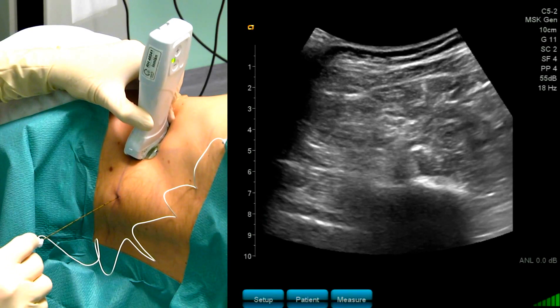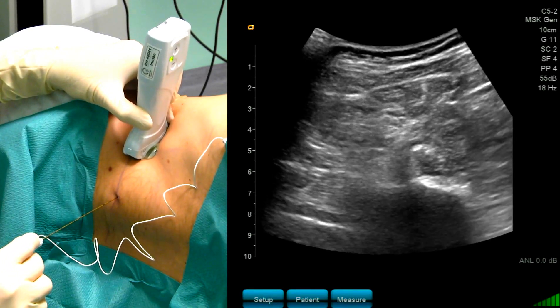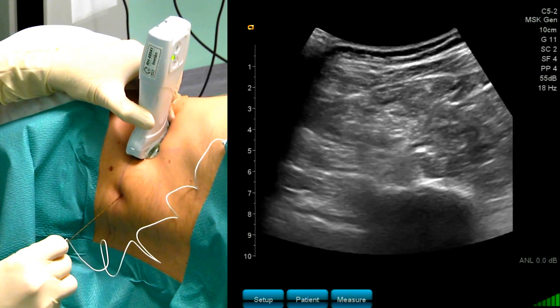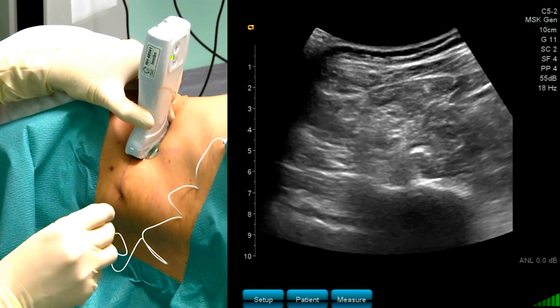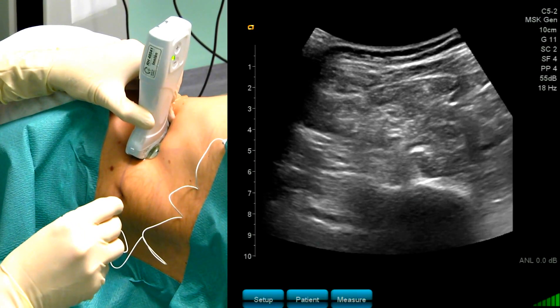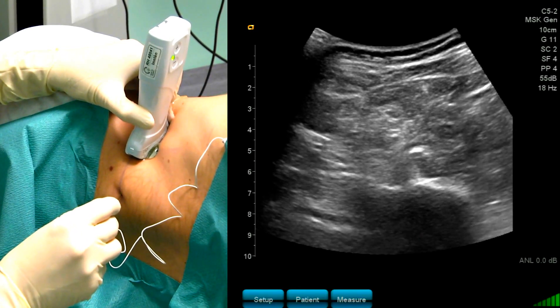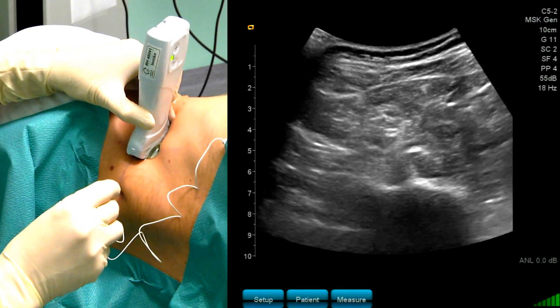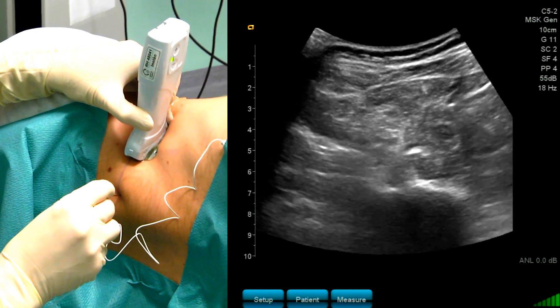We can see the nerve. We cannot see the transverse process and we cannot yet see the needle. The challenging moment is to get the needle into the image in the first centimeters, but now you can also see the needle.